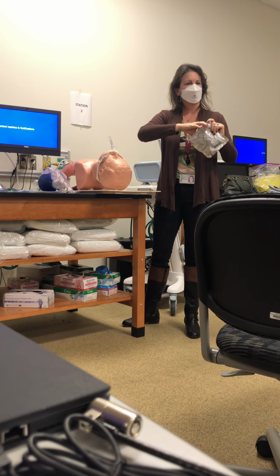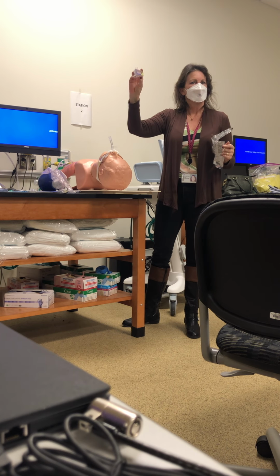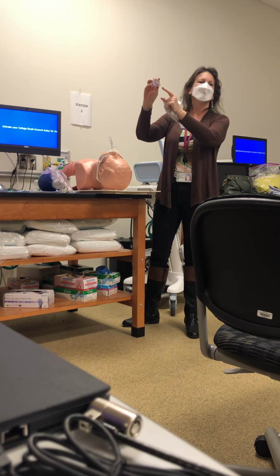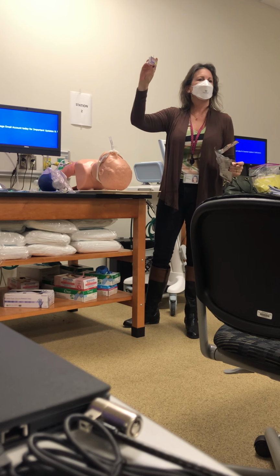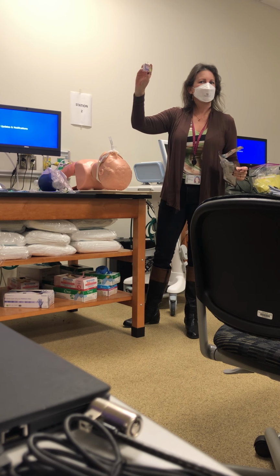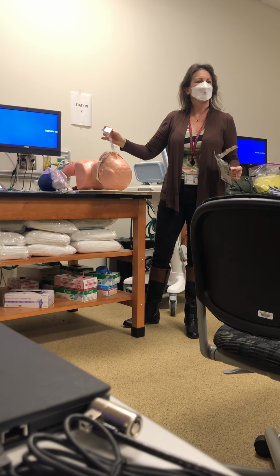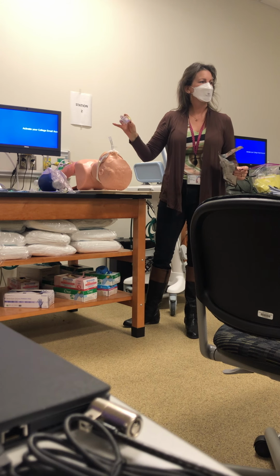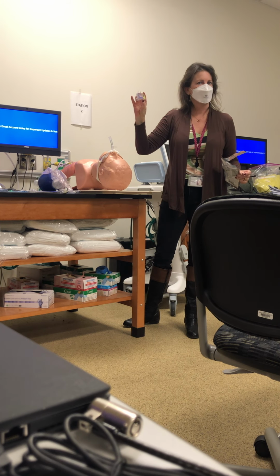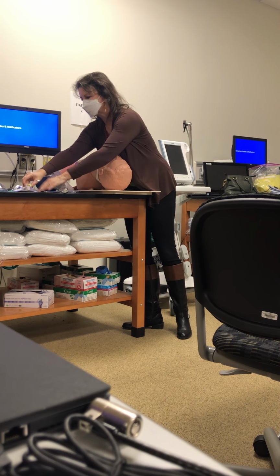What does the easy cap do? What is it for? Yours have already been exposed. This is brand new. So when you get it out of a package, it's purple. Okay, it turns to yellow once it detects carbon dioxide. Okay, so we would put it on the patient to make sure that the patient's intubated in the trachea as opposed to the esophagus. All right? So that's what this is for. Okay, so we've got this ready.